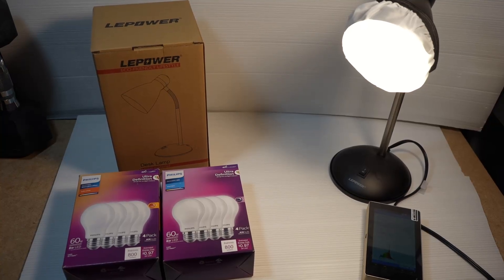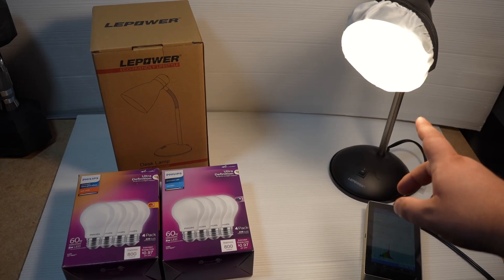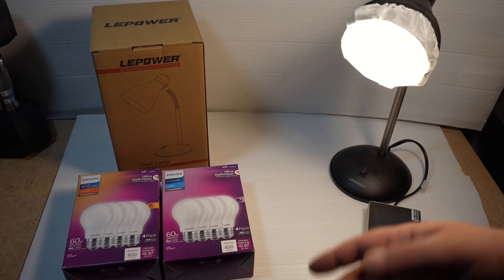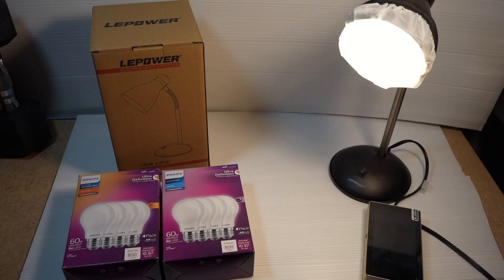Hey folks, it's Andrew from Gemba Red, and today we are making and testing a DIY bright light therapy device. It's not much of a DIY — it's just setting up a simple desk lamp. You can get any desk lamp like this one; I got one from Amazon for cheap.